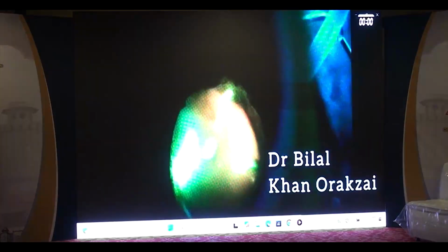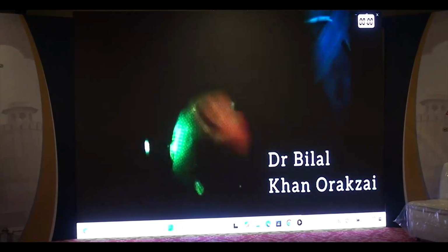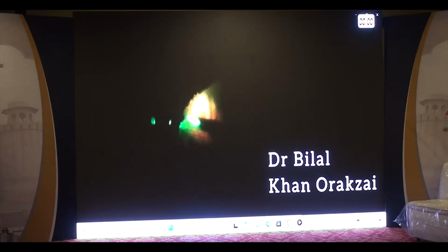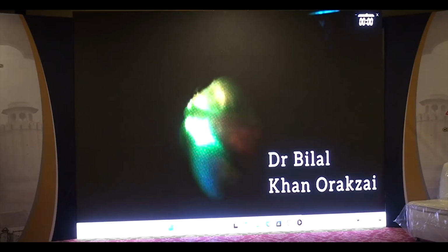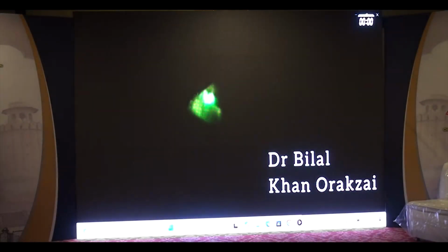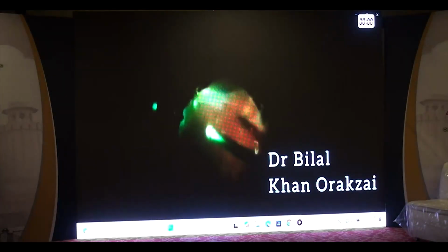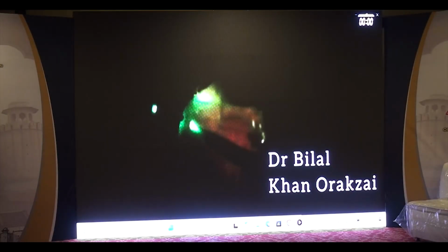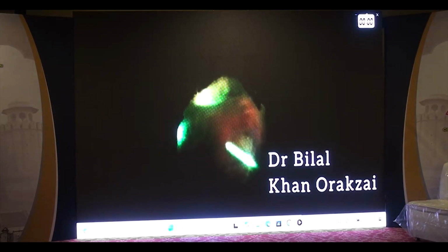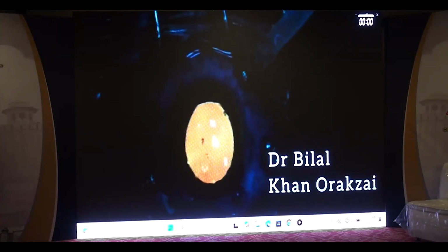Now one haptic is just stuck there, and I'm relieving it. And you are seeing, I'm not pulling it, just to avoid any tear. This is with indentation. One should be very patient during this time. Now the IOL has been relieved, just at the posterior pole.